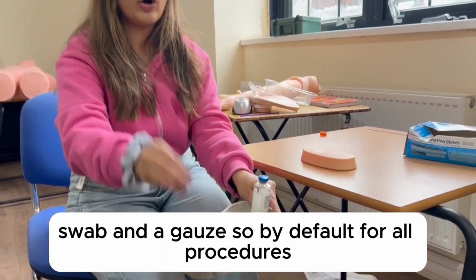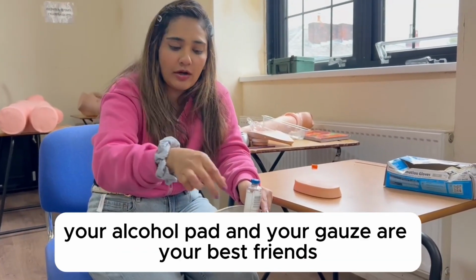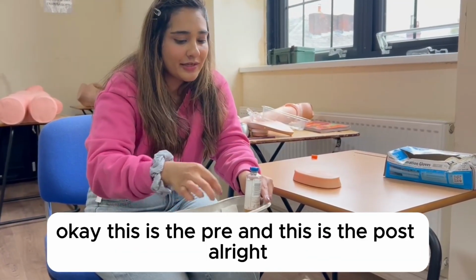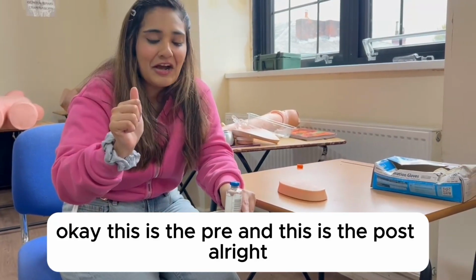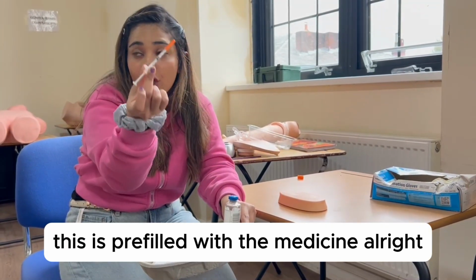By default, for all procedures, anything you're about to do, remember your alcohol pad and your gauze are your best friends. Okay, this is the pre and this is the post. All right, next obviously is the subcutaneous injection. This is pre-filled with the medicine.